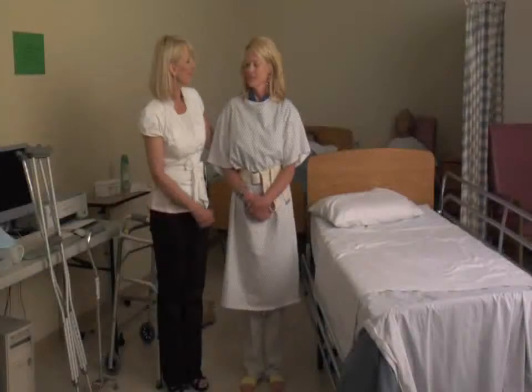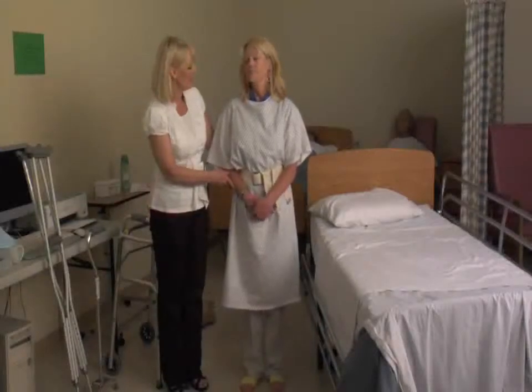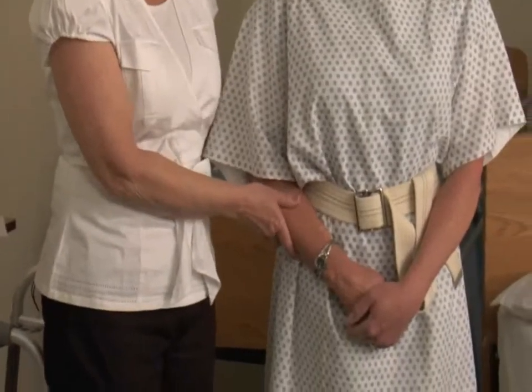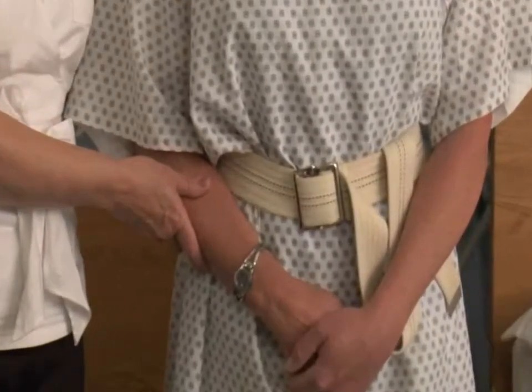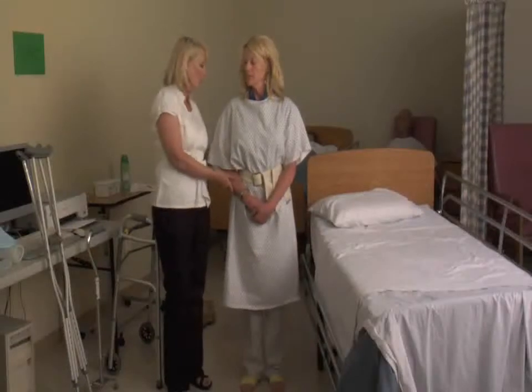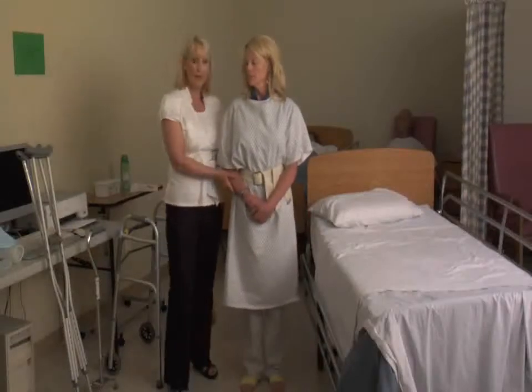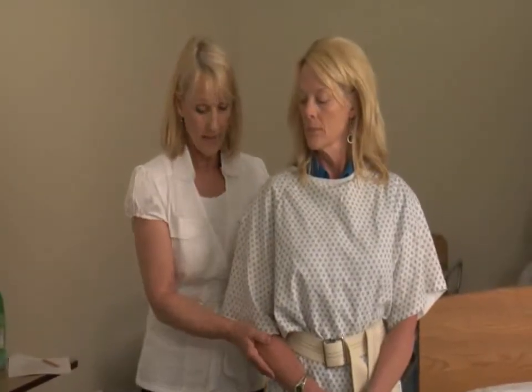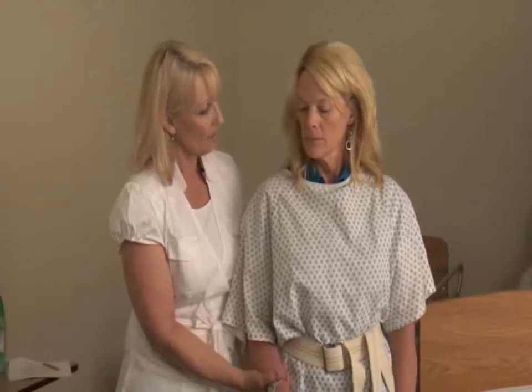All right, I'm going to help Mrs. DeBurke take a short walk. So I have her gait belt in place. She's had a stroke, so she's weak on her right side, and we always want to stand on the weak side. So I'm going to hold the gait belt in the back, and I can stand either to her side or I can stand to the back, and I'm going to support this weak arm.